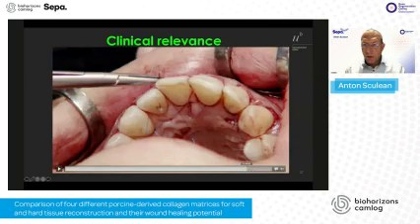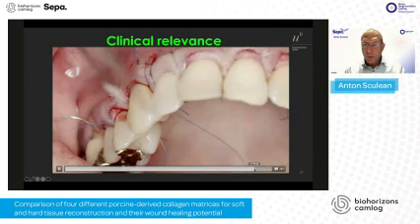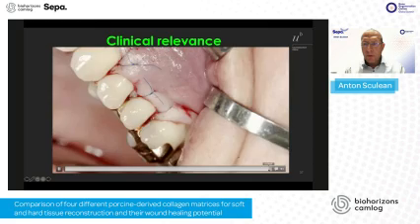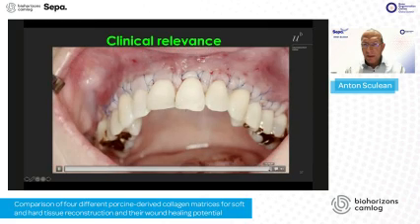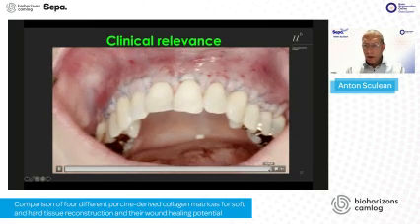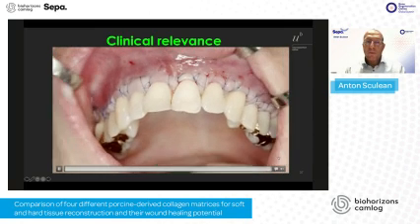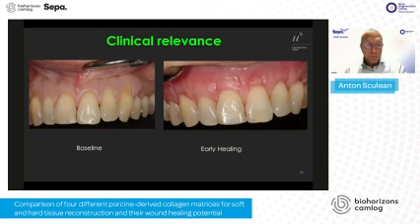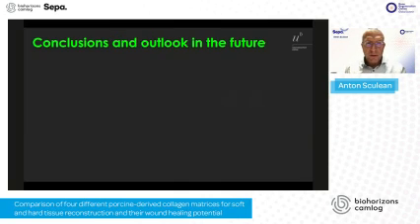And you can see now, I don't want to show you all the area, but please observe here the coverage of the graft. I like to cover it completely. And you see, I did a surgery from almost first molar to first molar. And let me show you now the early wound healing. That's about 2 months later. Looks very nice. And also the color is very, very natural. You don't see the difference between the pristine side and the treated side.